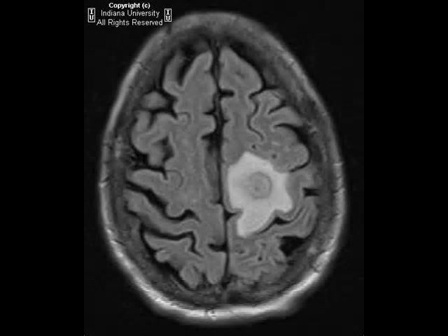On computed tomography (CT), cerebritis appears as ill-defined low attenuation and shows thick ring enhancement that may progress centrally on delayed images. With capsule formation, the abscess shows central low attenuation because of pus or necrotic debris and a rim of slightly higher attenuation surrounded by low attenuation vasogenic edema. After contrast medium, a ring of enhancement corresponds to the capsule.